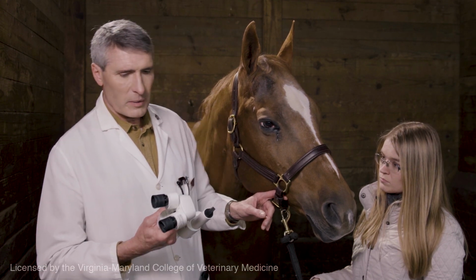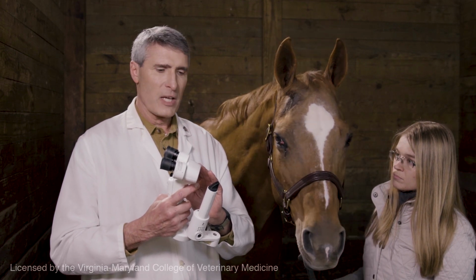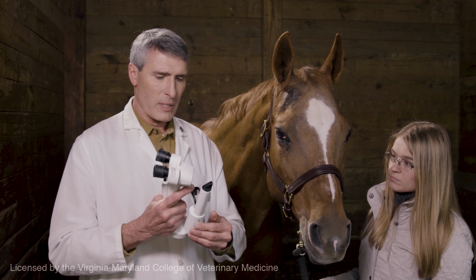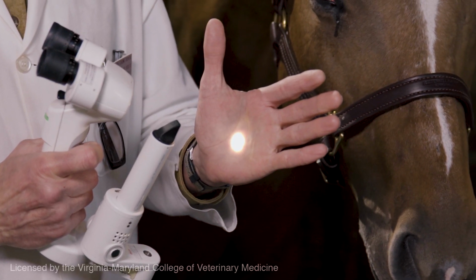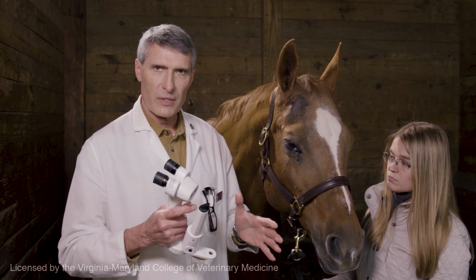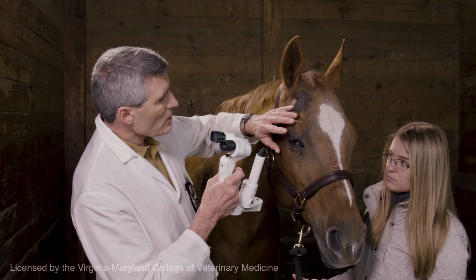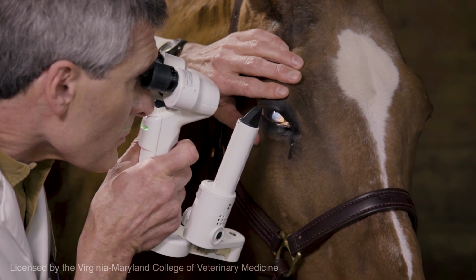So the principle behind the slit lamp is that you have a microscope for magnification, and then you have an adjustable light source. What I'm going to do here is make the light source a bright, wide light, and this will allow me to just generally look at the surface of the eye. And so what I'm going to be doing right here is gently prying her lids open. Ella's being a good girl. And I'm just going to scan across.